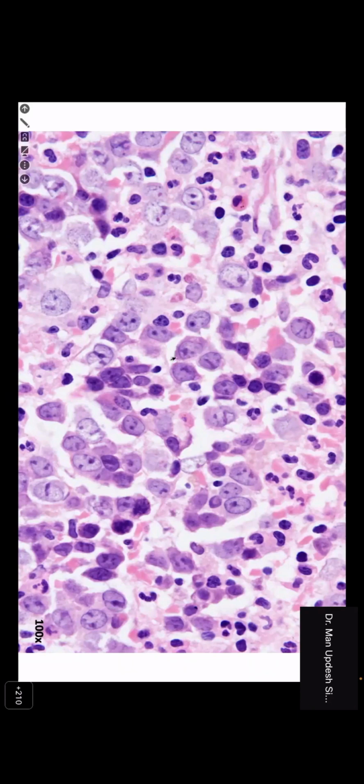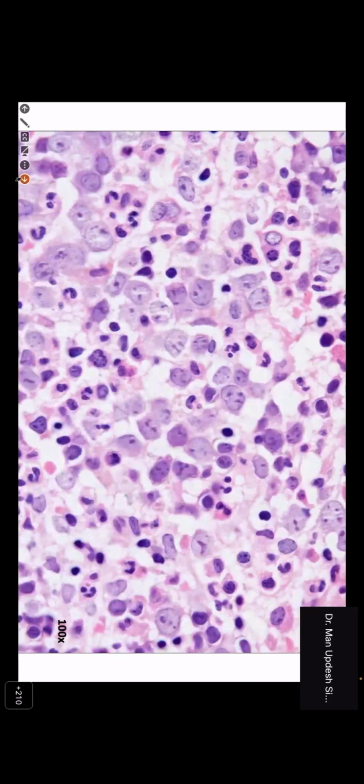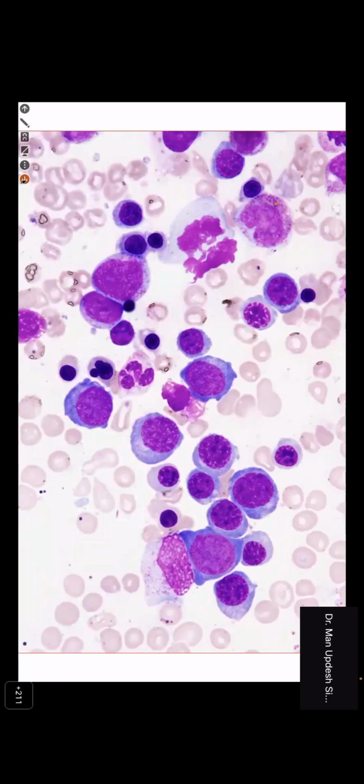Okay, so we move forward to the next slide. Good. So similar findings there also. I add some information: this patient also had continuous fever for some time. There are, of course, cytopenias, and clinically, the bone marrow request form came to rule out tuberculosis and hematological malignancies, since there was also a little hepatomegaly. So we had megaloblastic erythropoiesis with marked hypercellularity, and we have already discussed the cell.